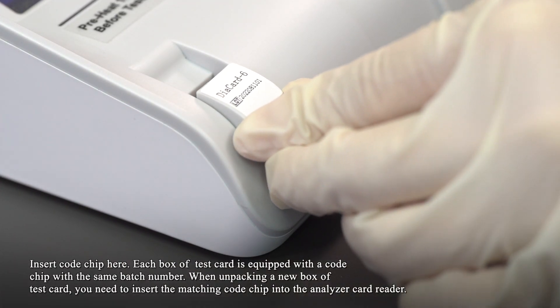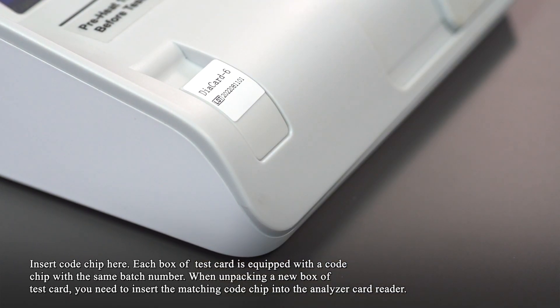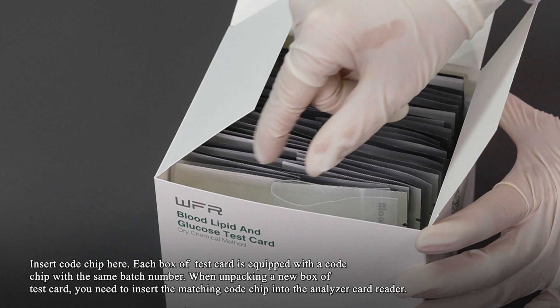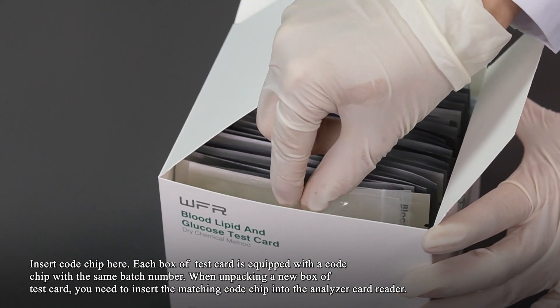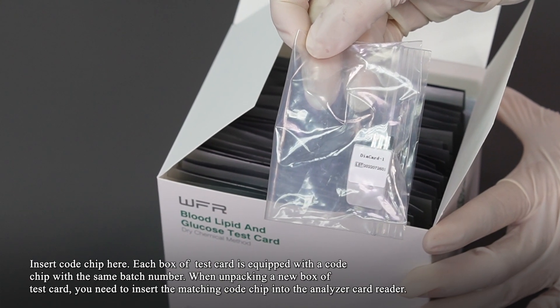Insert the code chip here. Each box of test cards is equipped with a code chip with the same batch number. Remember, when unpacking a new box of test cards, you need to insert the matching code chip into the analyzer card reader.